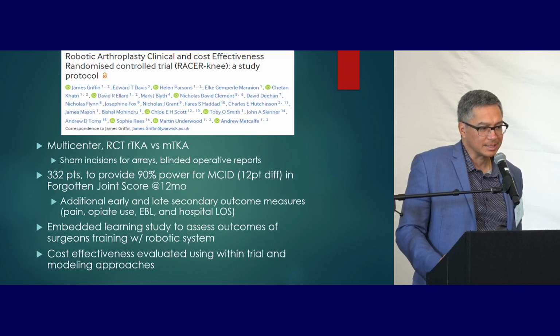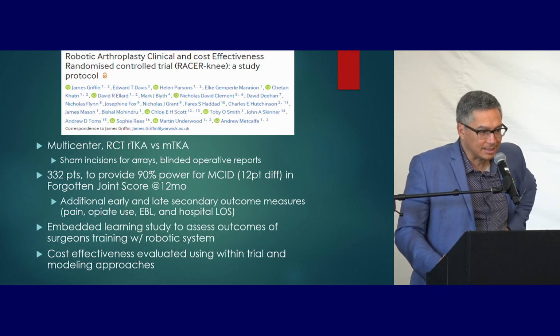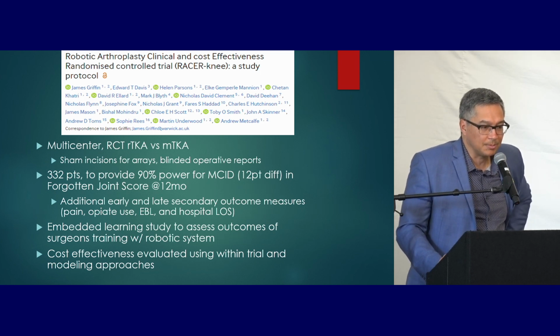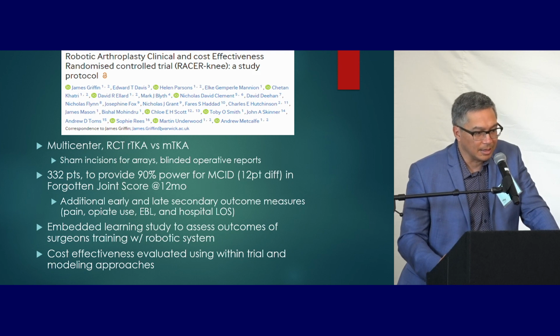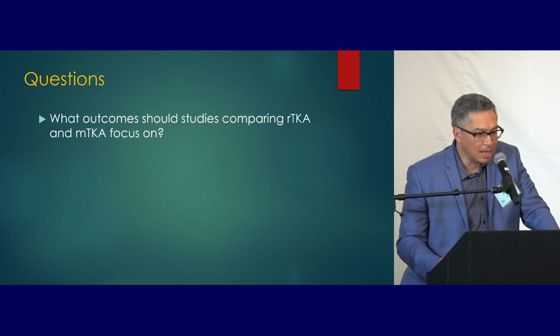I think probably the most interesting study that I saw in the literature hasn't been completed yet, but it is a multi-center randomized controlled trial out of the UK. They are going to include sham incisions for the arrays, and they're going to have blinded operative reports. They're going to need over 300 patients to provide 90% power to demonstrate an MCID for the Forgotten Joint Score at 12 months, and then they will obviously collect additional endpoints as well. They're also going to look specifically at the learning curve through young surgeons training with the robotic system, and include, most importantly, I think, a cost effectiveness model to look at the actual benefits of these robots. So I think we've probably talked about some of these.